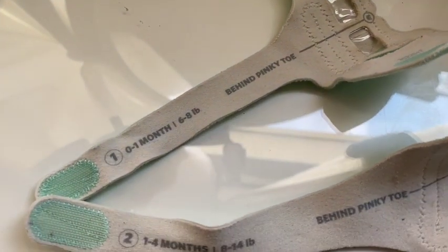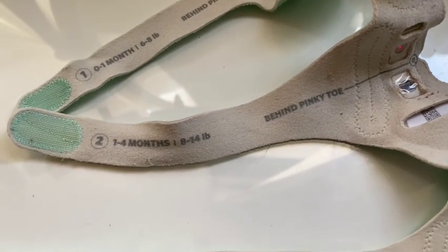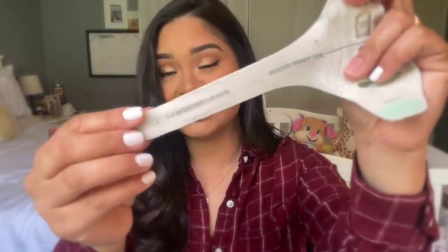You also get three sock sizes. Size one is zero to one month, six to eight pounds. She's in size two, which is one to four months, eight to 14 pounds. She's almost six months but still fits size two because she's tiny — just over 14 pounds. Size three is four to 18 months with no weight requirement.